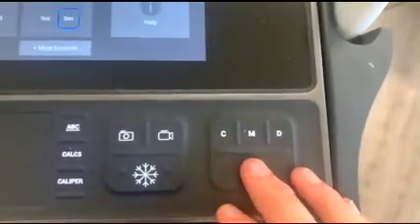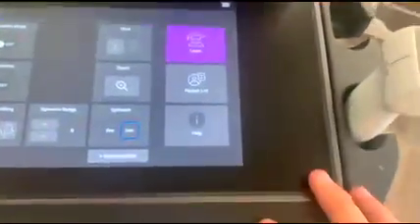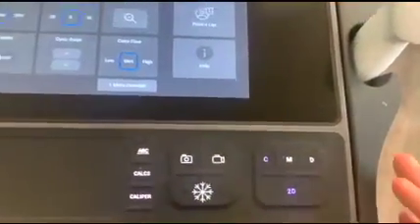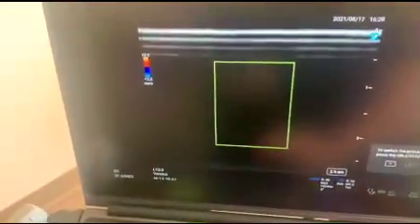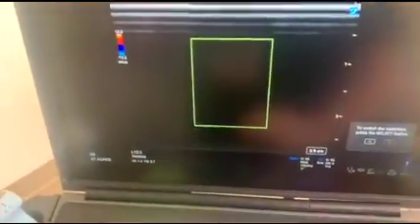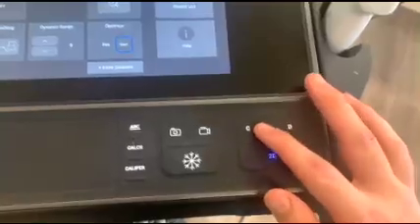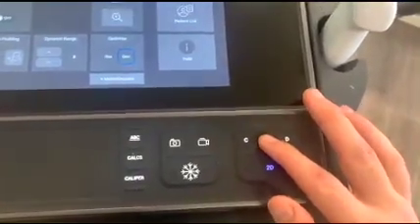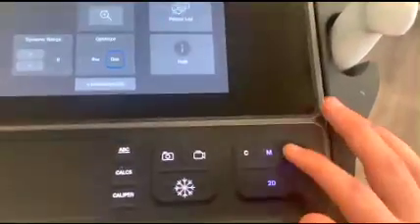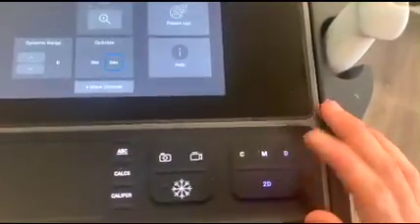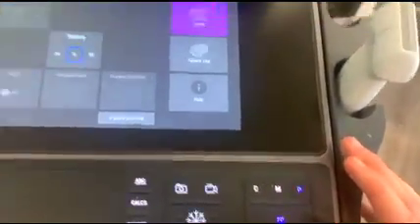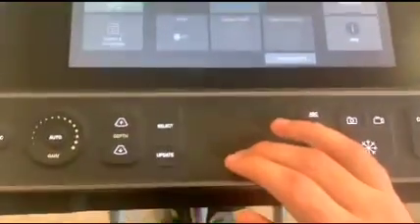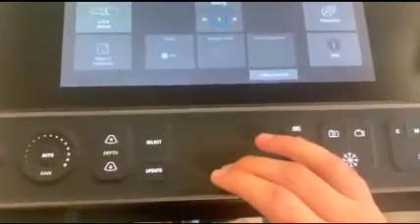This far right square will have some standard options to choose from as well. 2D picture is just going to be your standard image. If you click the C, that will give you the opportunity to have a color Doppler. If you click M, that'll give us M mode. And if you click D, that'll generate a Doppler. You can use the touch pad here to change those things.